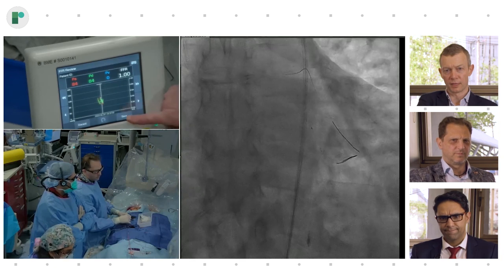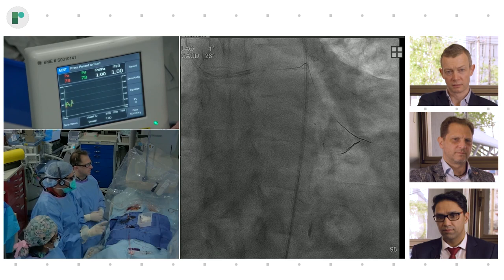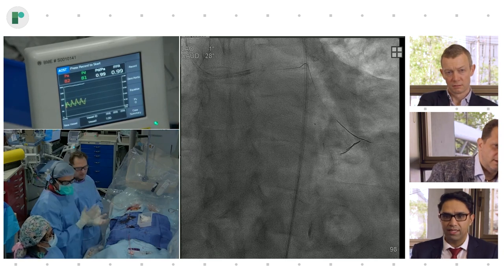Yeah. So here you started with an FFR or DPR in this case in the circ, right? I think we're doing the LAD here. You might be right.